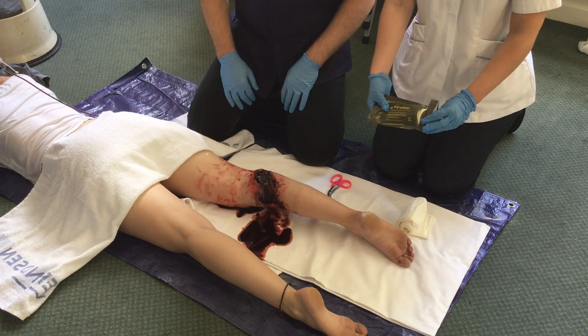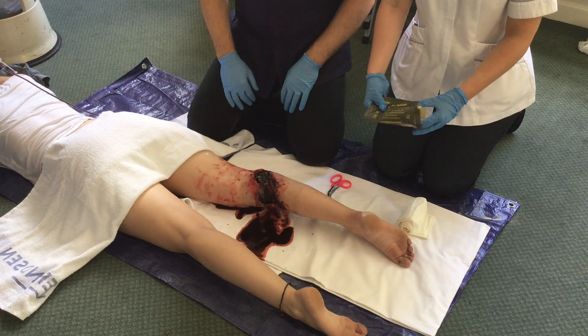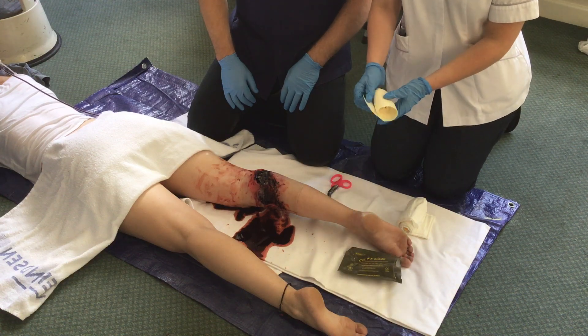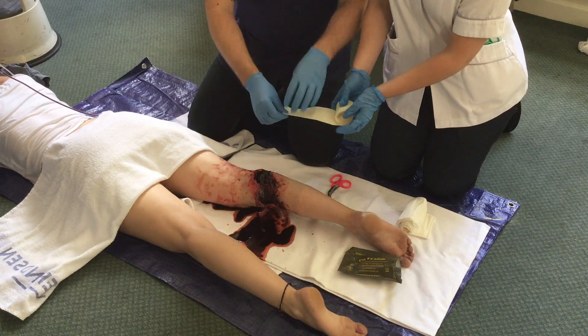The first operator removes the roll of CELOX gauze from the packet. This is kept in a rolled up position and a working end is passed to the primary operator.